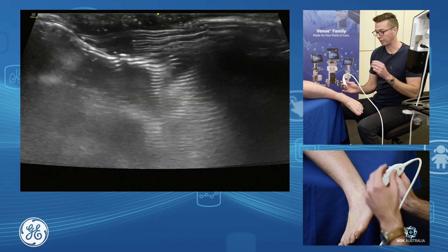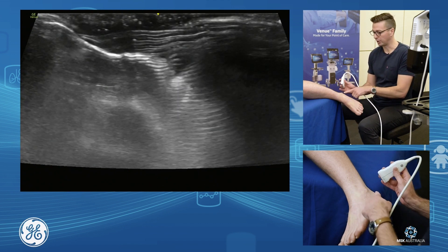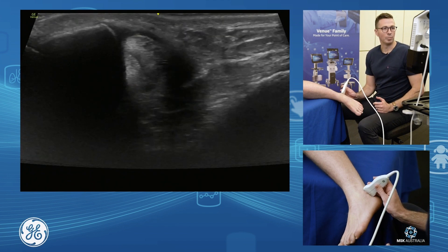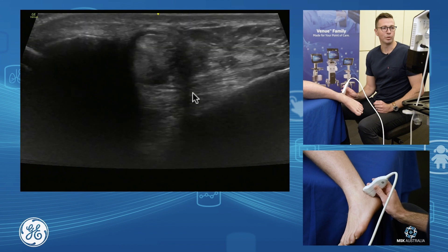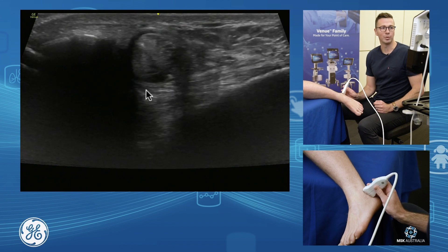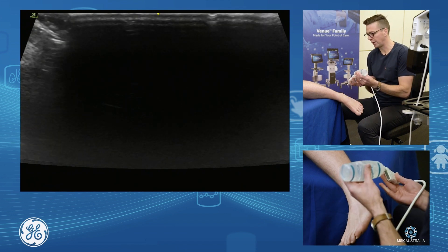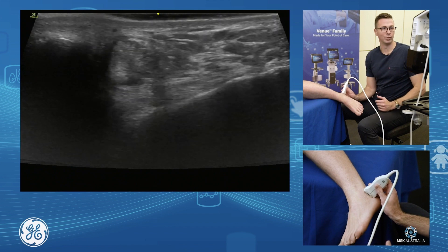From here we're going to go around to our calcaneofibular ligament. We're going to orientate our probe from our fibula down towards the point of the calcaneus. We're going to have a look at our peroneal tendons and look underneath our peroneals, fanning forward and back to get some of the calcaneofibular ligament in through here. If your patient has really bony ankles, add more gel to fill up all those bony voids.